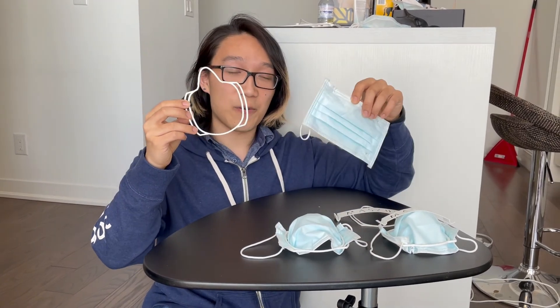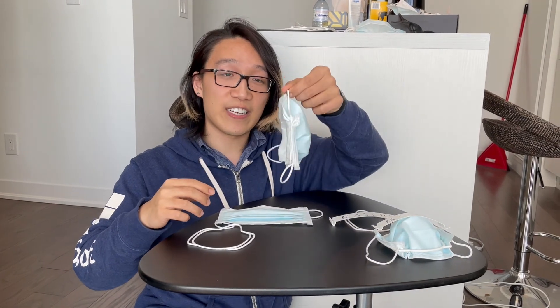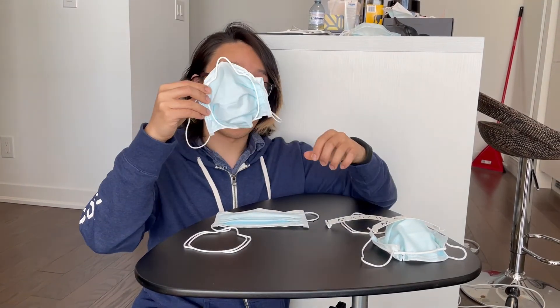So what is Maskis? It starts with a 3D printed mask fitter that is custom fitted to your face using computer vision. We combine that with a typical surgical mask to make an already very nicely fitted mask that is fitted to your face.